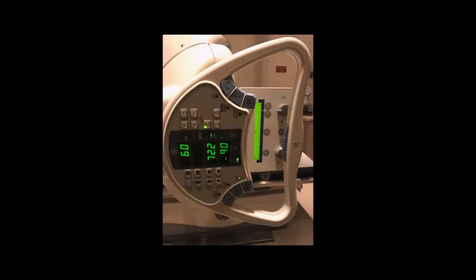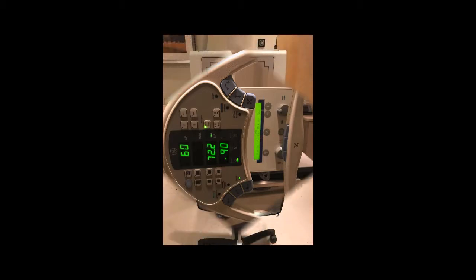Before getting the patient, I bring them up on the computer and set the room up. Since we are starting with chest, I use a 14 by 17 grid and set the tube at 72 SID. And don't forget radiation protection, always shield your patients.